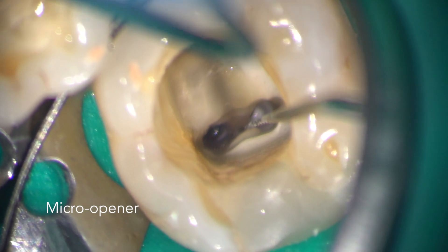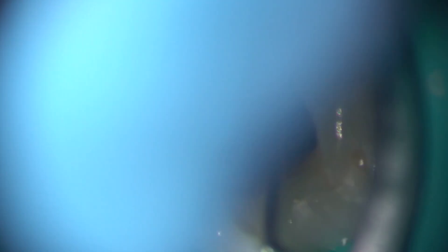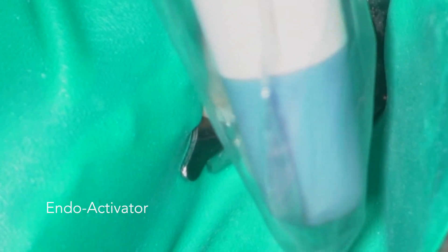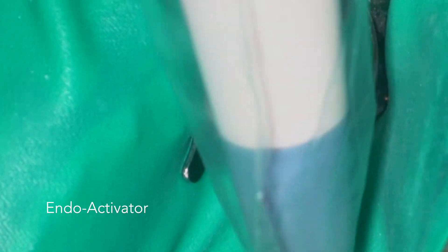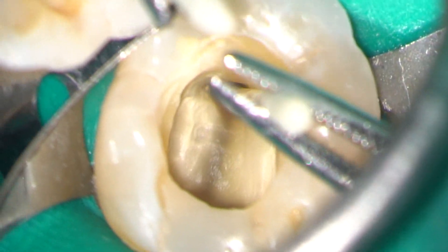I spotted some tags of GP deep in the isthmus between the mesial canals and removed this using a micro opener. The canals were dried with matched paper points prior to obturation using a single cone bioceramic technique with BioRoot RCS.